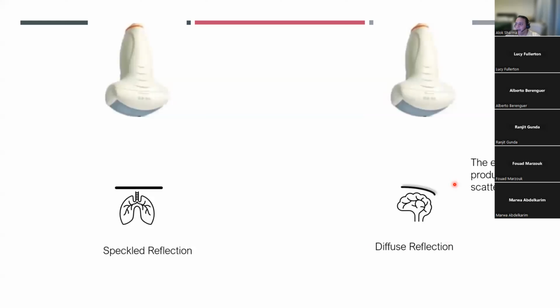On the other hand, when you do the brain, say, for example, and you're using a cranial ultrasound probe, the echoes are scattered, because naturally pleura is straight, but the brain is convex and it has meninges in 3 layers. These will produce echoes that are scattered. They'll have diffuse reflection. But not only that, the echo that goes into tissue will have diffuse reflection. And because of that diffuse reflection, you will be able to understand the tissue anatomy better. I.e., when you do brain ultrasound, you can see things in intricate detail.